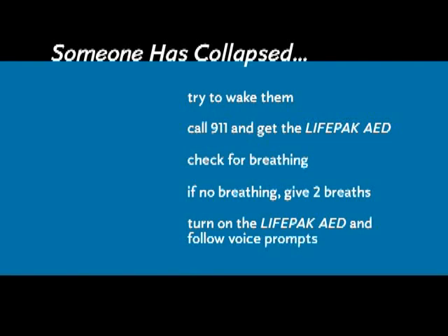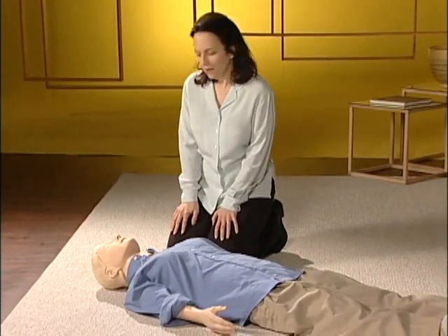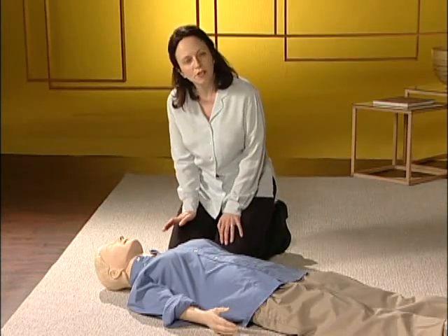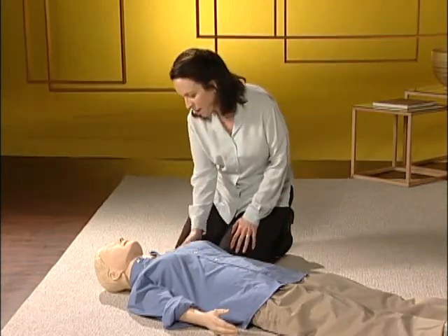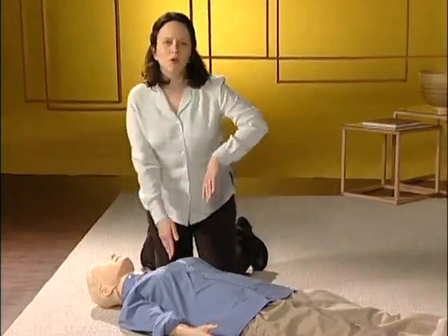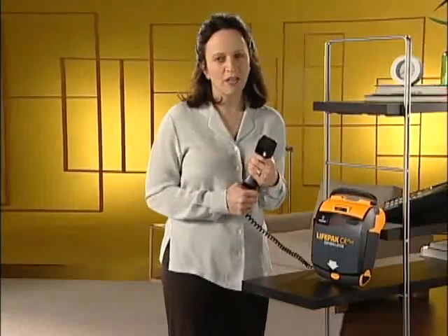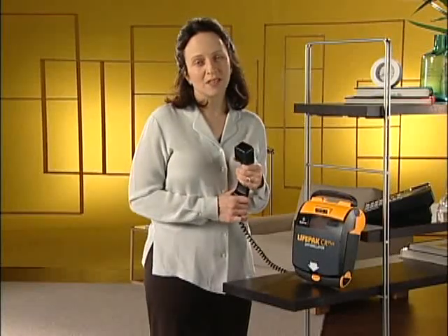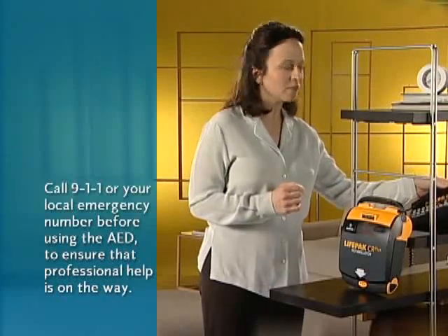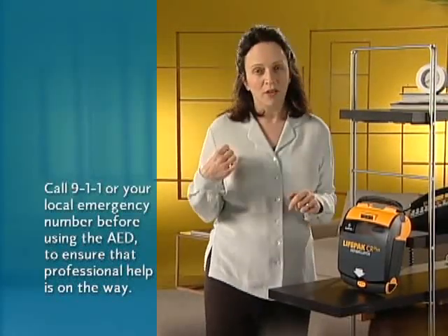Someone in cardiac arrest is unconscious and not breathing normally. They might not be breathing at all, or they might be gasping, or what seems like snoring. The first thing you should do is try to wake them by tapping or shaking their shoulder and calling out, 'Are you okay?' If you can't get them to wake up, call 911 immediately, even if you're not sure they're in cardiac arrest. Tell the dispatcher that someone has collapsed and you can't wake them. Tell them you have an AED. If someone else is with you, one of you should call 911 and get the AED while the other starts CPR.